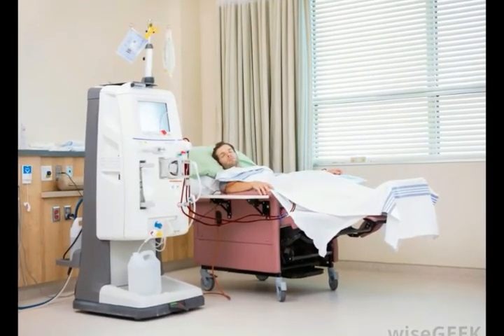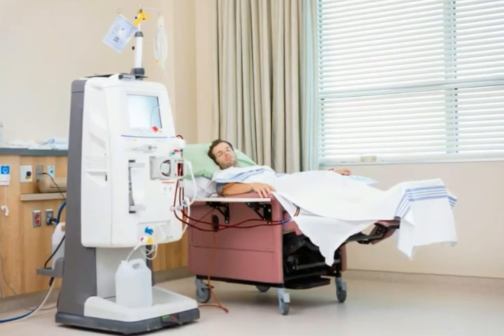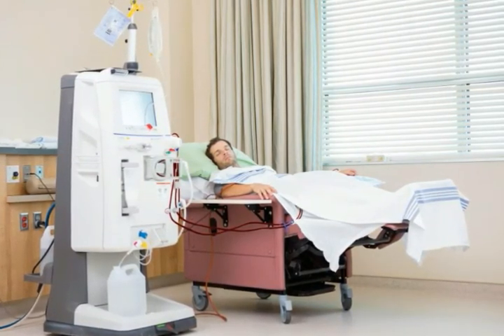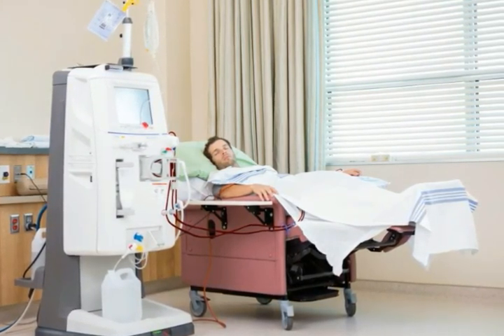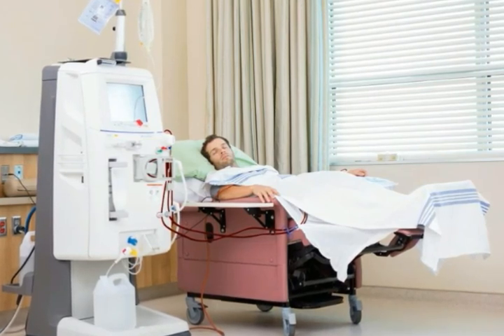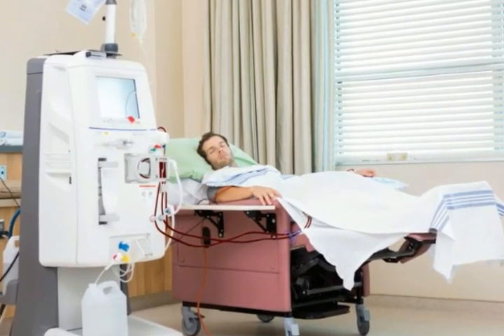Water balance must also be achieved in the blood with CRRT. During haemodialysis, water will either be added to or removed from the blood using the principle of filtration, or the forced movement of fluid across a semi-permeable membrane using pressure. The haemodialysis machine uses a pump to place pressure on the blood, forcing it through the filtering tubes. When water needs to be removed from the blood, strong pressure is placed on the blood in the haemodialysis tubes, forcing water out of the blood and into the dialysate solution. Blood with a low concentration of water will be exposed to a lower pressure, and less water will be forced out of the blood.